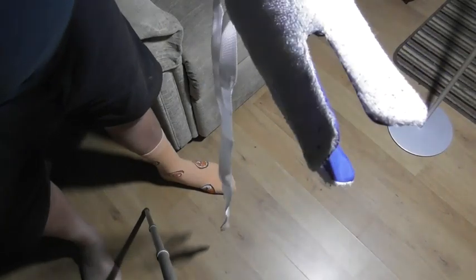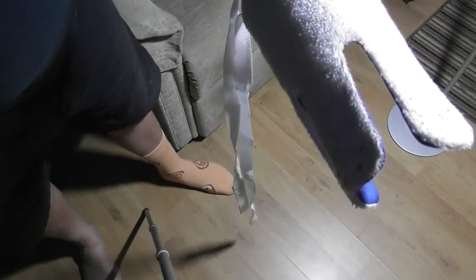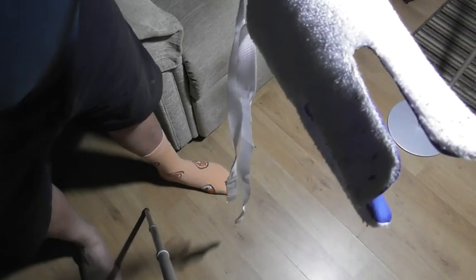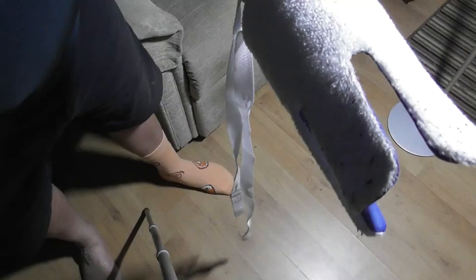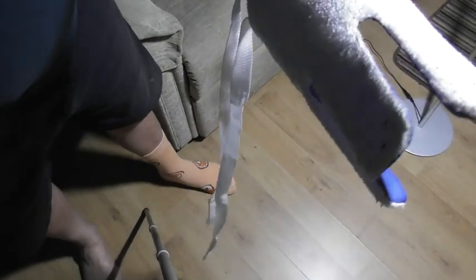Many years ago I was recommended this NRS SockAid after I damaged my leg and hip badly. I found it difficult to put my socks on without pulling on the scar tissue. Not great if you've got arthritis either. So I found this thing — I was recommended it by an occupational therapist and it's been brilliant.